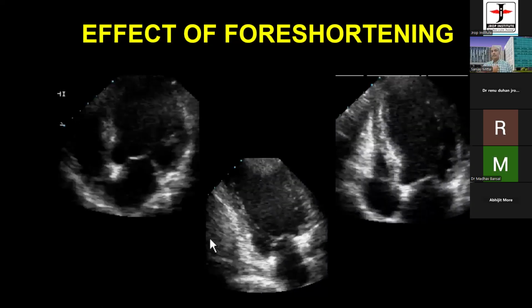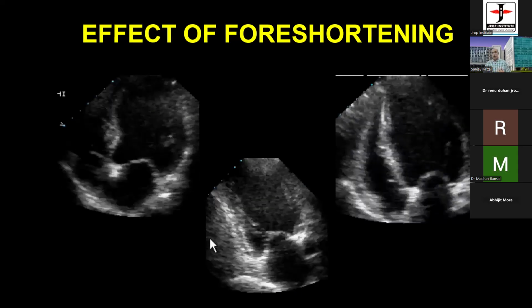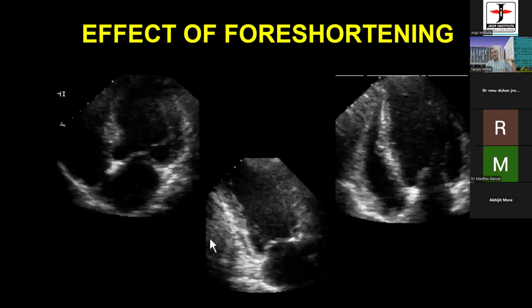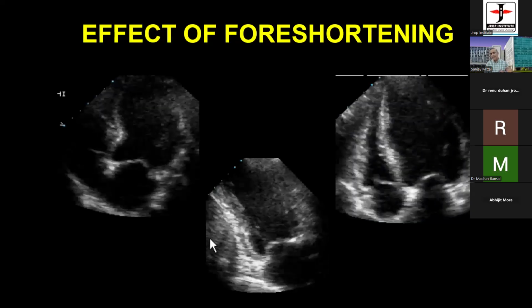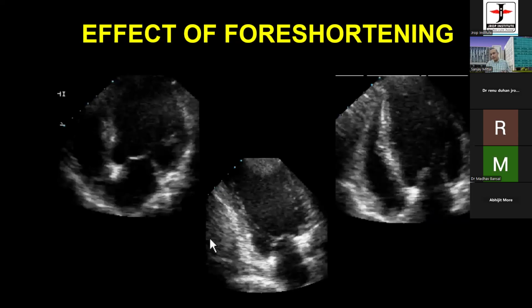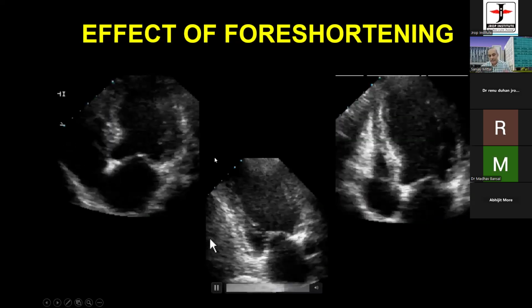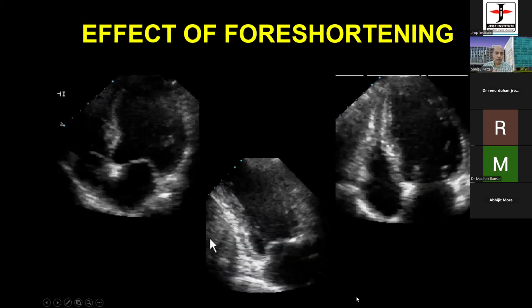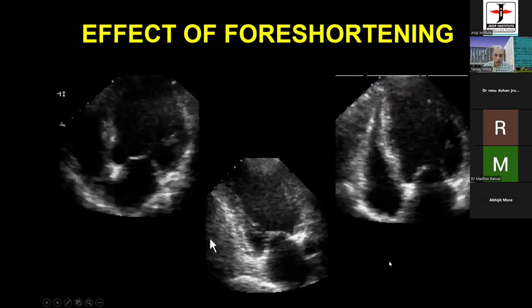They put the transducer on the parasternal long axis view and take the transducer all to the apex. And they are so happy, okay, I've made the four-chamber view. They start evaluating at that point. But you have to understand the apex is the outermost and downmost structure. So keep on going out and down till you lose the heart and then come in. You would not commit such a mistake. Otherwise, you'll keep on making 20% ejection fraction into 45% without any surgery, without any intervention, and you'll become God.